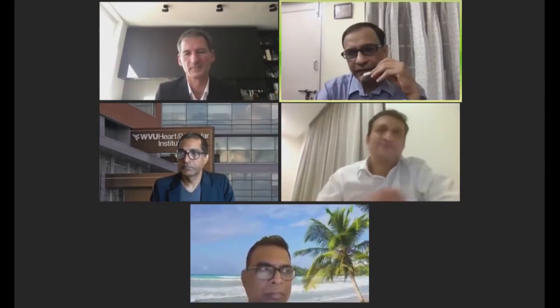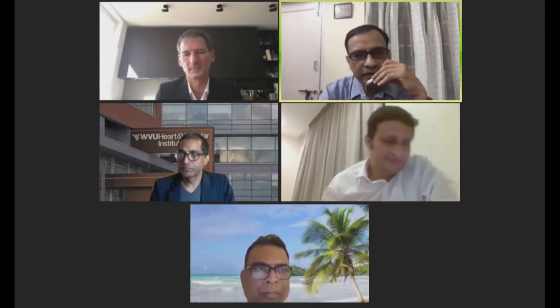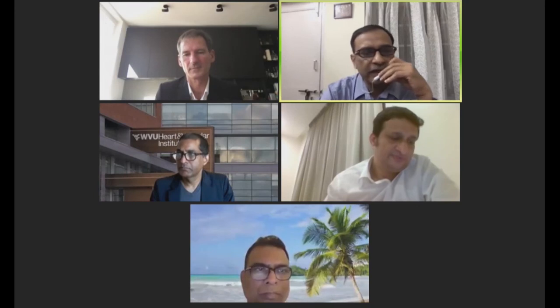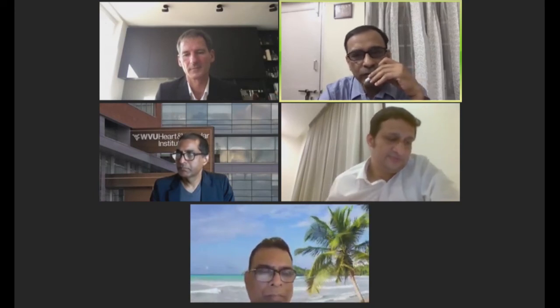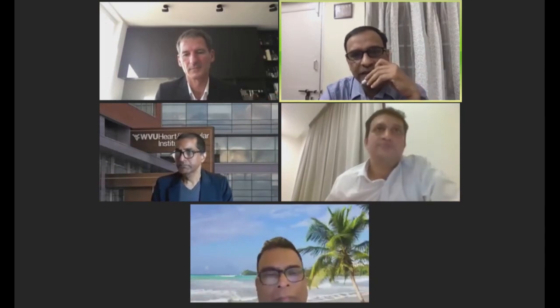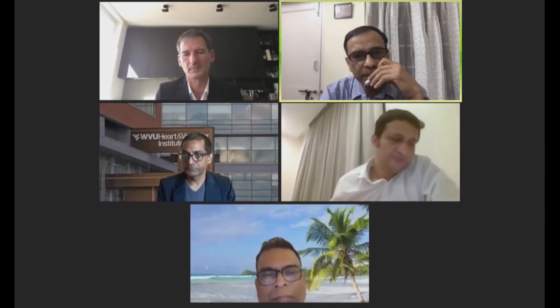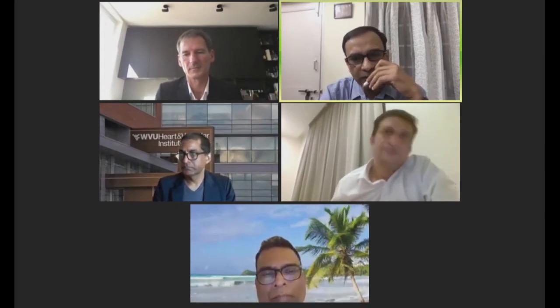So the landing zones are actually different for all the 3 devices. As Professor Carsten has said, the Lambre's landing zone is the most forgiving because it just doesn't matter. You need to size the umbrella in such a way that it keeps the disc under a little bit of pressure, so it will hold in place and the hooks have a place for traction.